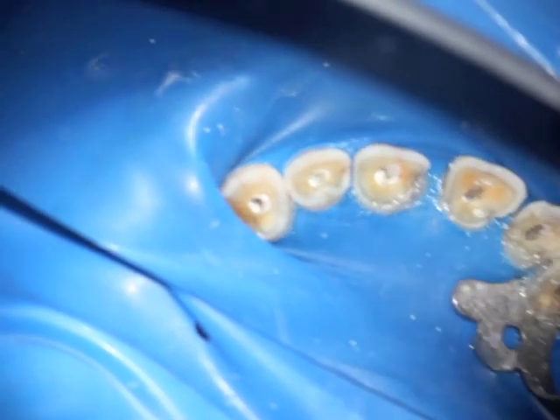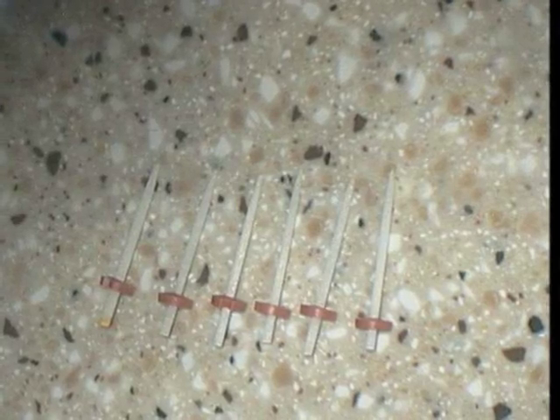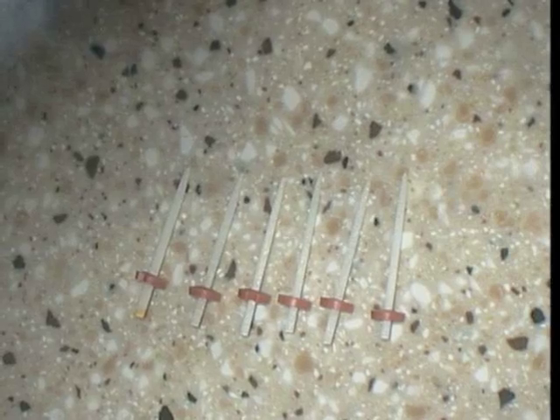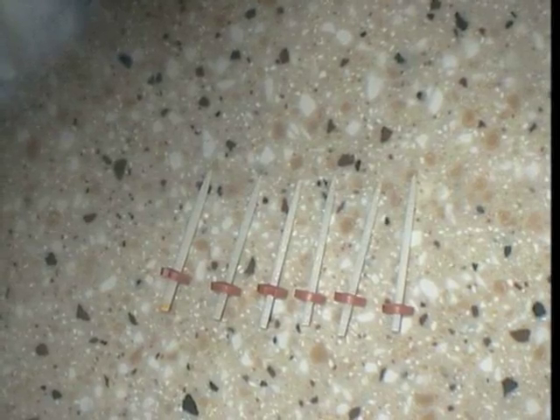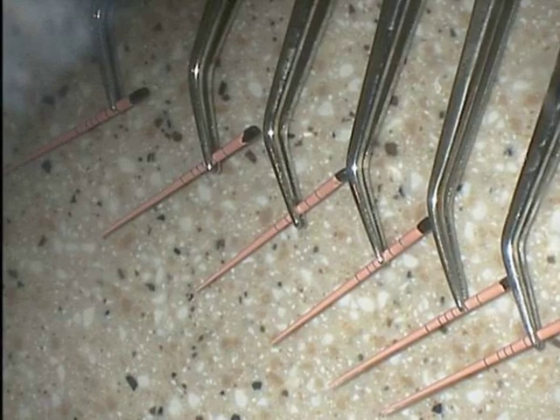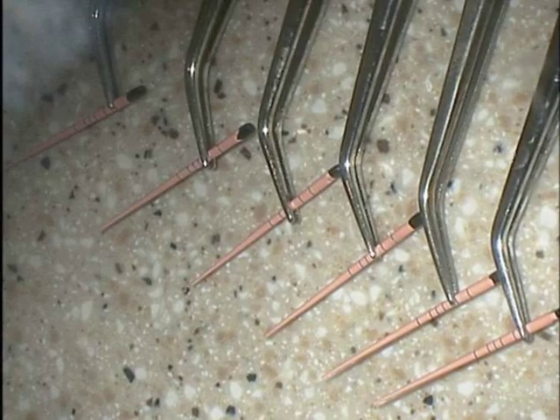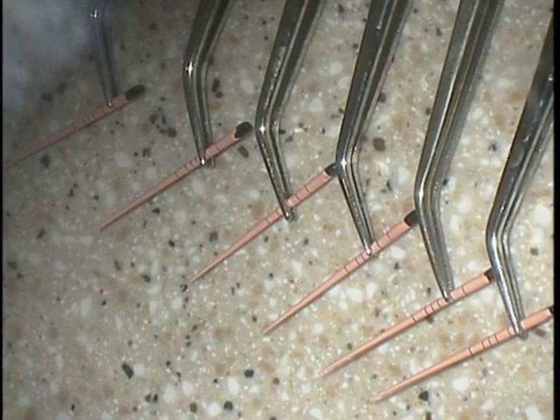Following placement of the sealer in all canals, you can see that we have the fitted fiber posts. By deducting the size of the fiber posts from the length of the canal and the fitted gutta-percha cones that we already have, we can actually determine the remaining amount of gutta-percha at the very tip for each canal that needs to be cemented in order to have a post space beyond that.